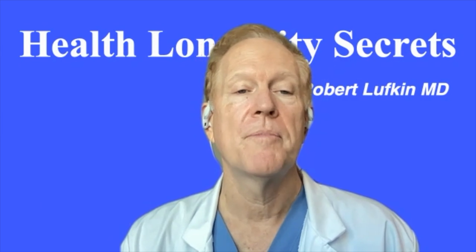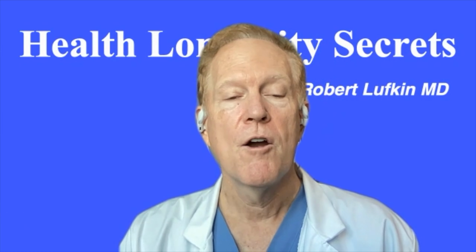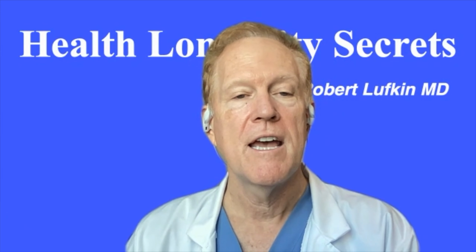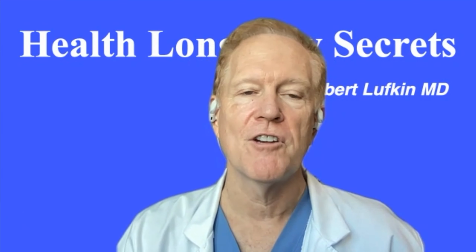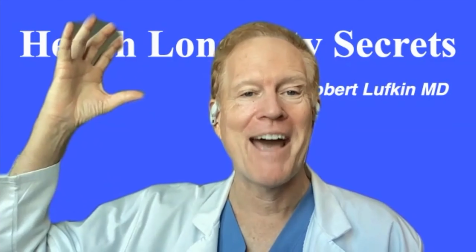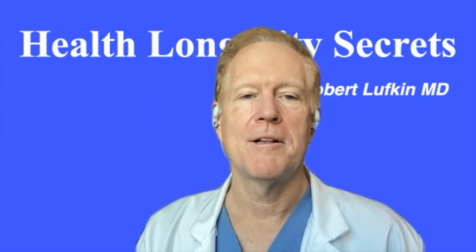But on the other side of the coin, it's also very powerful having a technique like body composition, where you can quantify something, apply the lifestyle, and then a few months later retest it. It's a very strong motivational factor for the patients when they can see their liver getting healthier, or their visceral fat decreasing, or their hippocampus growing back and increasing in their brain back to a normal size. It's really very, very remarkable.